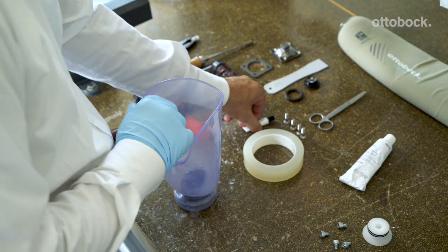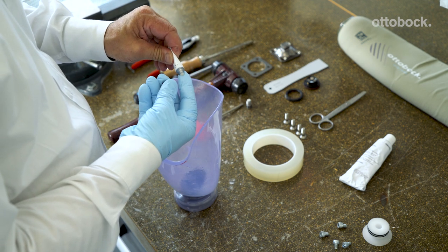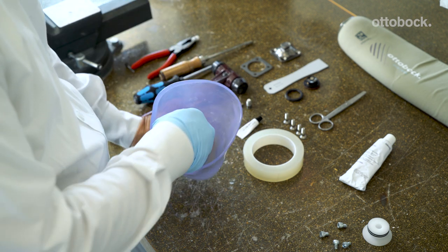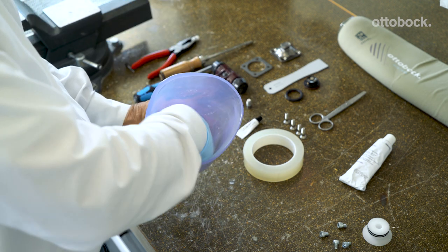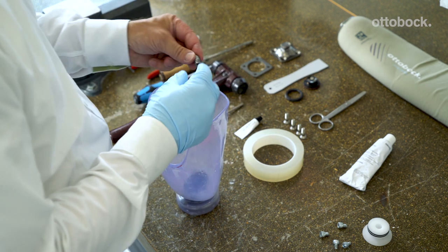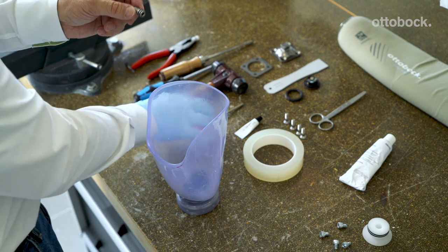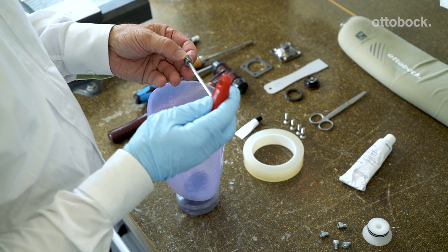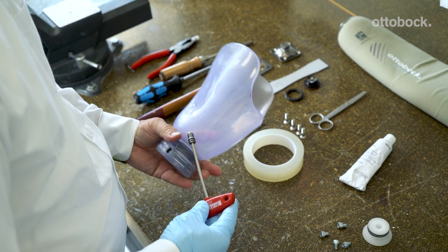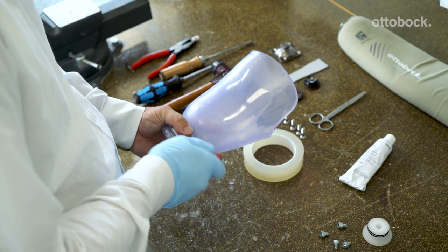Using the small tube of grease provided with the DVS pump kit, apply a thin layer to the inside of the DVS pump housing as shown. In addition, apply grease to the two O-rings on the valve housing. Be careful to get no grease on the duck bill valve, and insert as shown. Screw the valve bushing into the DVS housing tight enough to make a seal.